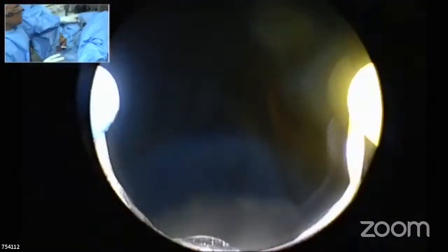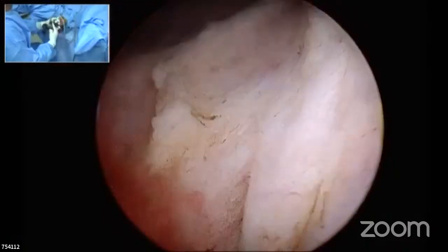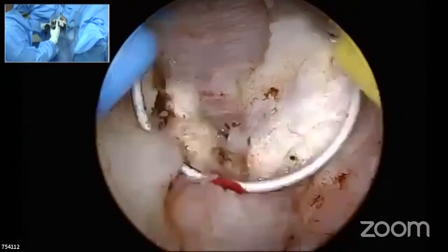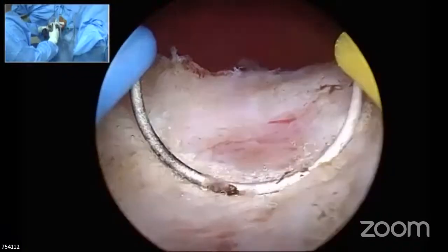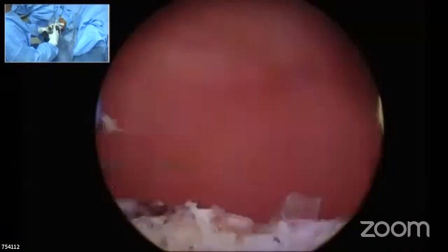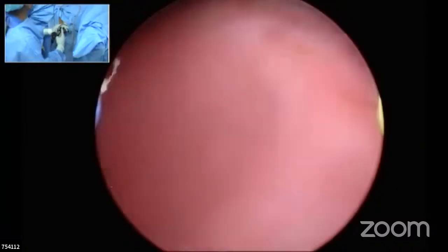So these are the two traction points wherein there may be a stricture that can happen: the penoscrotal junction or the bulbomembranous junction. This I strongly believe. That's the reason why I avoid traction as much as possible. I don't routinely keep traction at any point of time. I think I finished. I don't see any pieces inside.